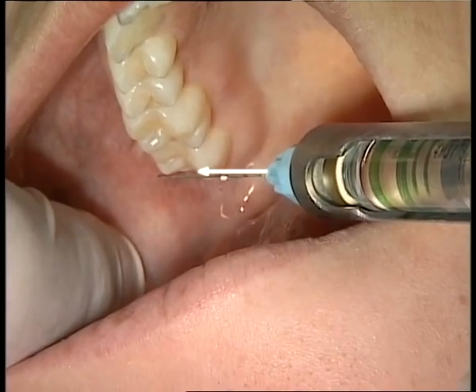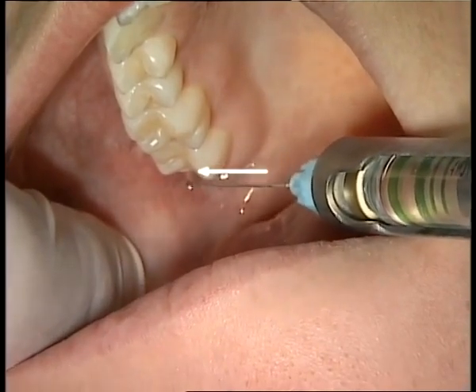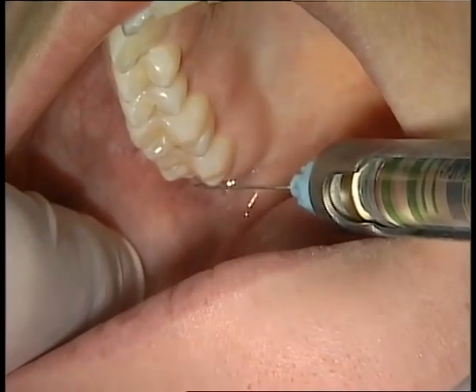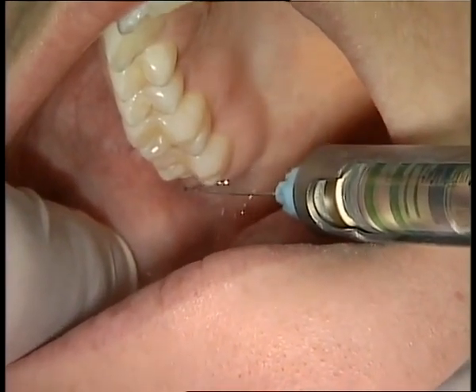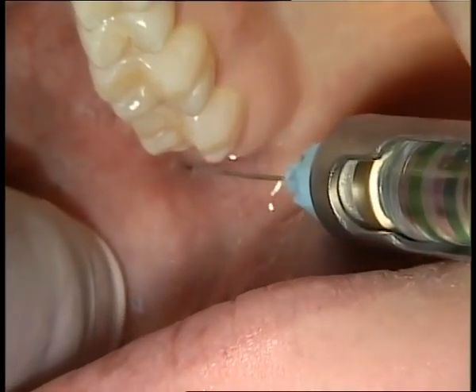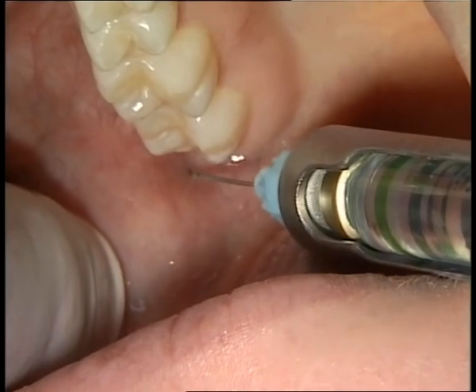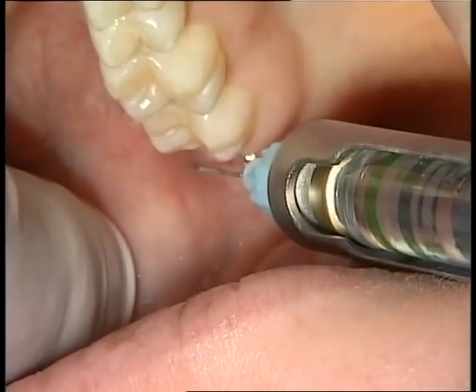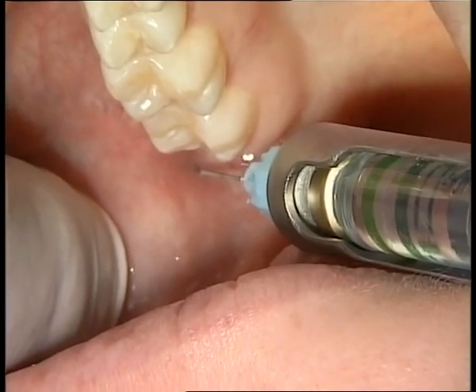The needle is placed just below the mesial palatal cusp of the maxillary second molar, and then the tip is moved just distal, about 2 or 3 millimeters distal to the maxillary second molar. This is the insertion point. The needle is then inserted until bone is contacted, usually at a depth of approximately 25 millimeters.